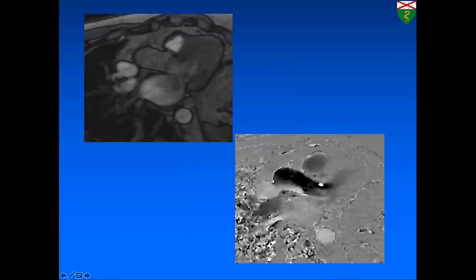We always perform a three-chamber view with phase contrast imaging to show aliasing due to flow acceleration in the LVOT region.